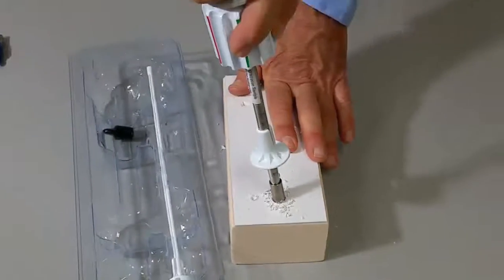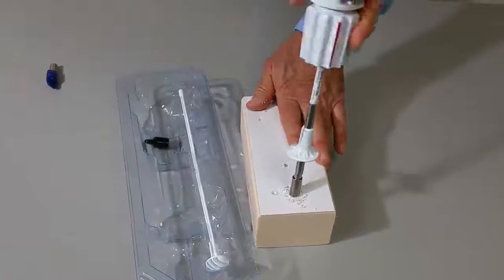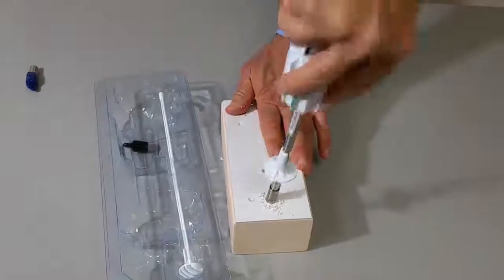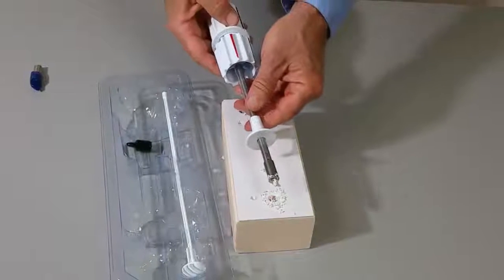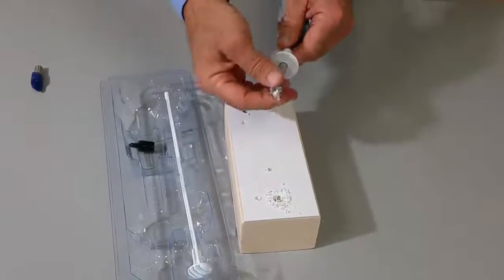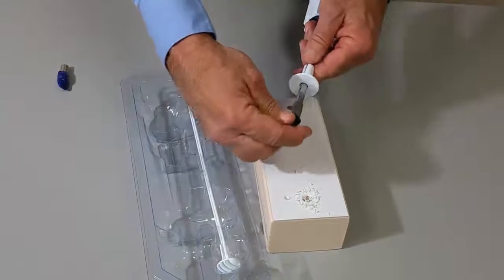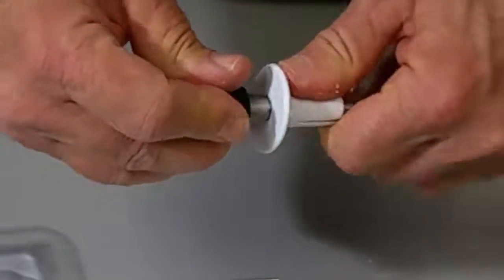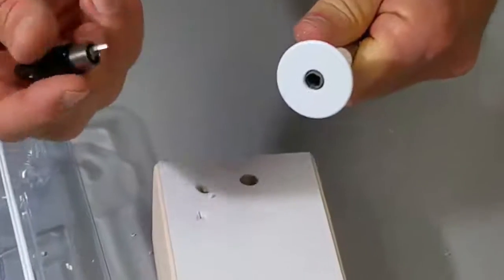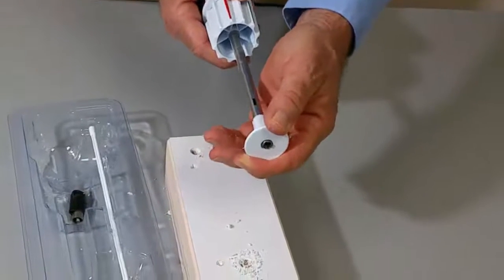At this point, depending upon the thickness of the cortex, one can proceed to harvesting the bone. In the thicker cortical bone, a slight oscillation with wobbling in a rotatory manner will enlarge the hole slightly to increase the hole size so that insertion of the trephine device is easier. Fragments of cortical bone can be collected if desired, but if you're simply interested in harvesting cancellous bone, you would cap the trocar tip and then by simply pushing this removal tool forward, the trocar tip comes off easily. You want to save that in the operative field in case you need to use it again.